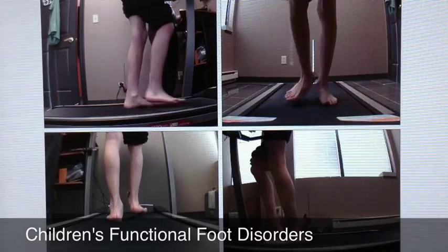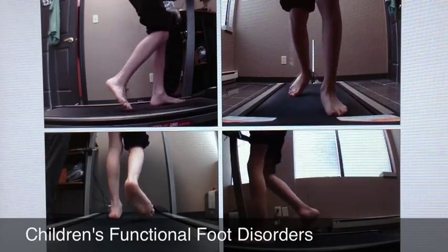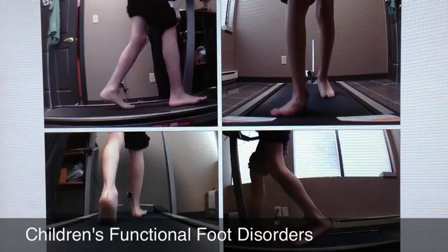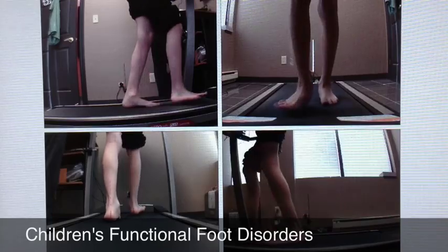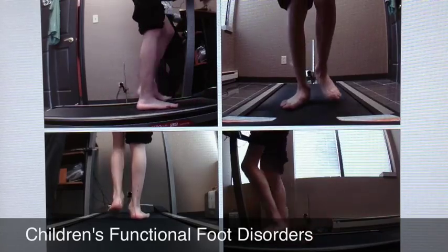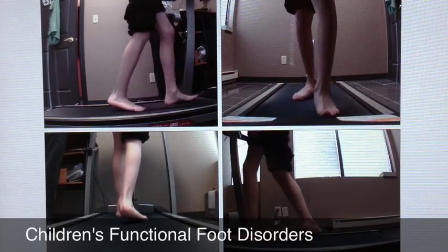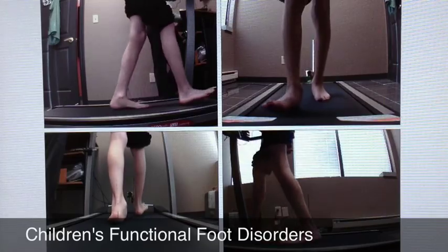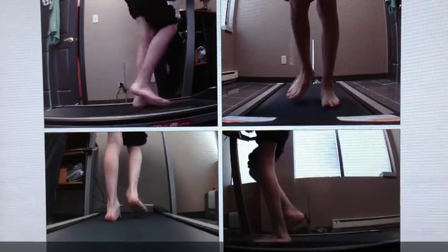One area that our system is very useful for is in the treatment of children's functional disorders. We are able to show parents the effects of poor foot function as well as the improvements gained over time with the use of functional foot orthotics.